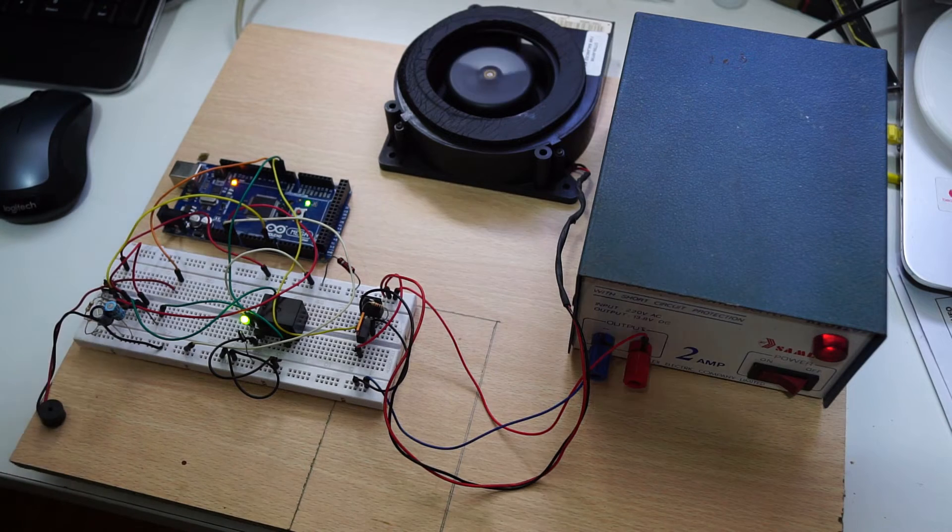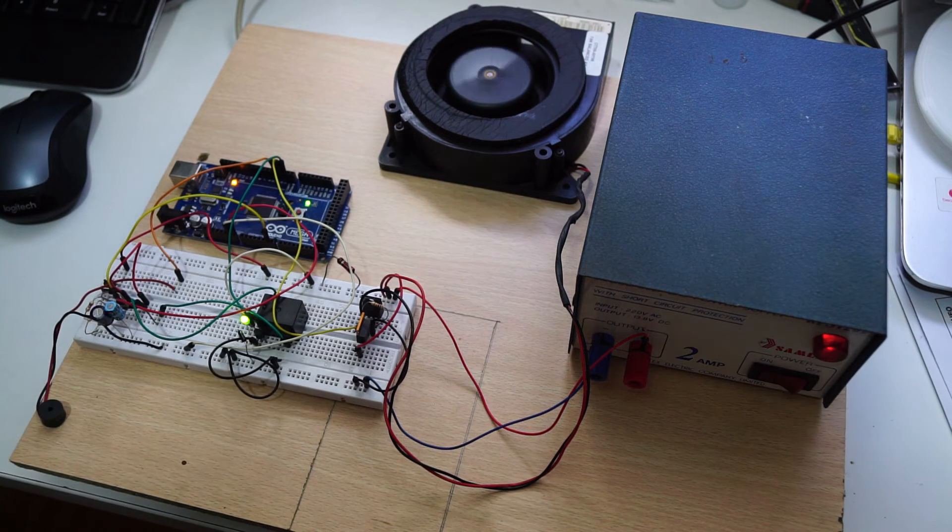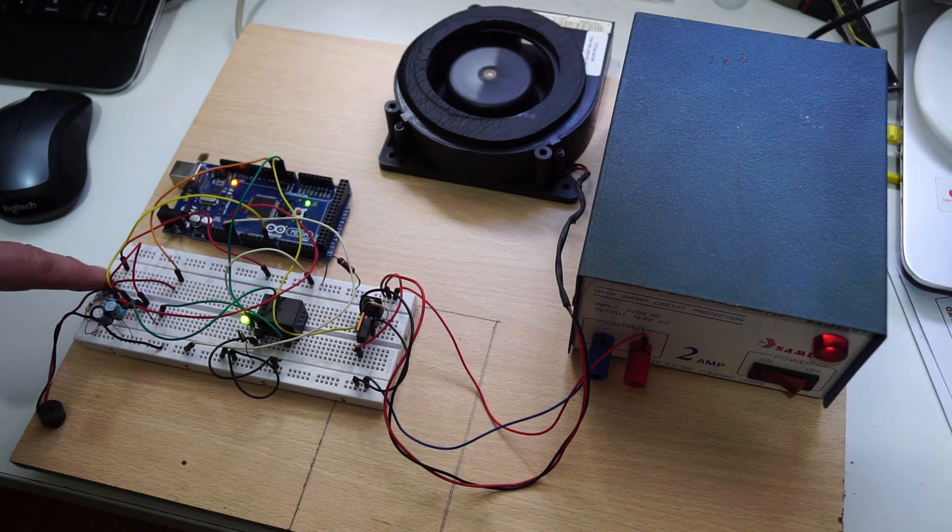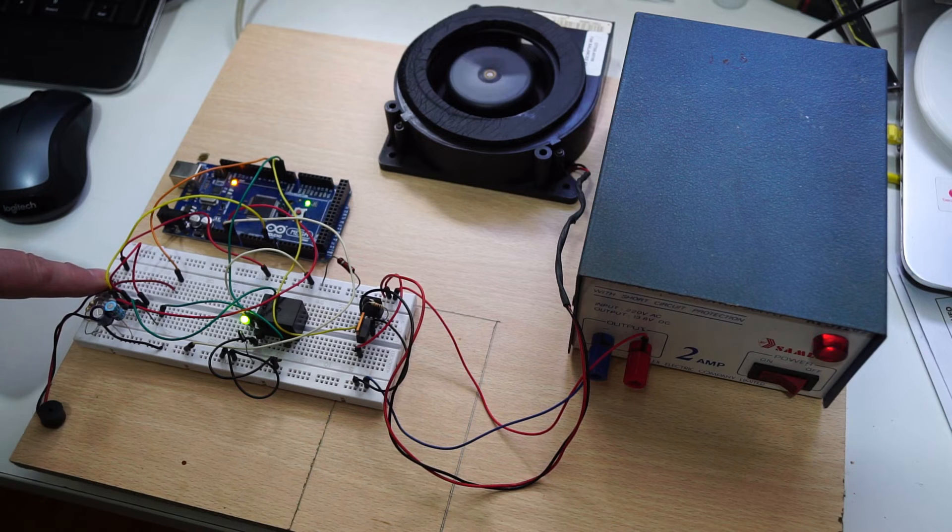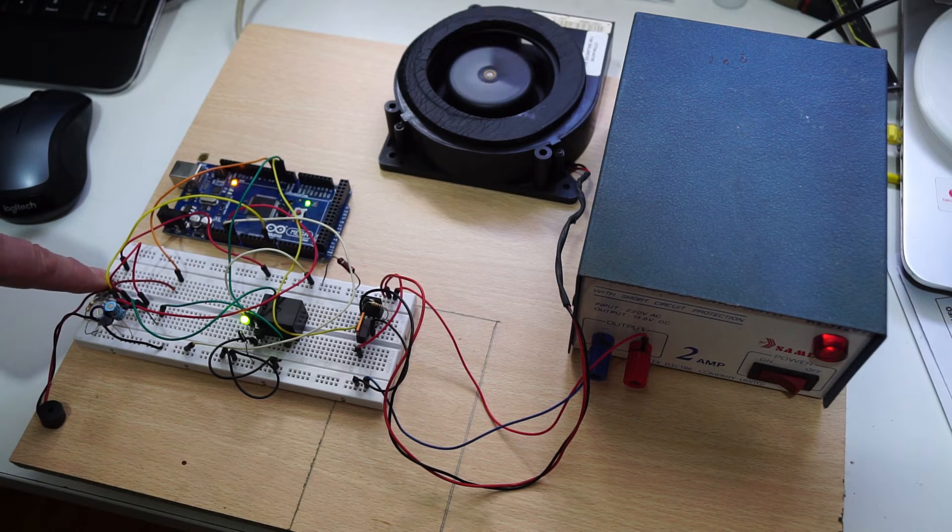Once the system is activated, the turbine speed is changed by pressing the key. There are three selectable speeds.